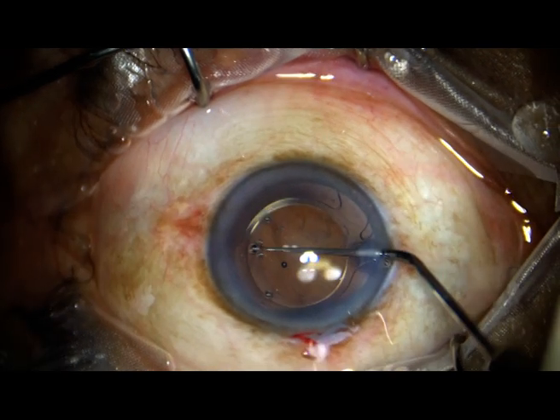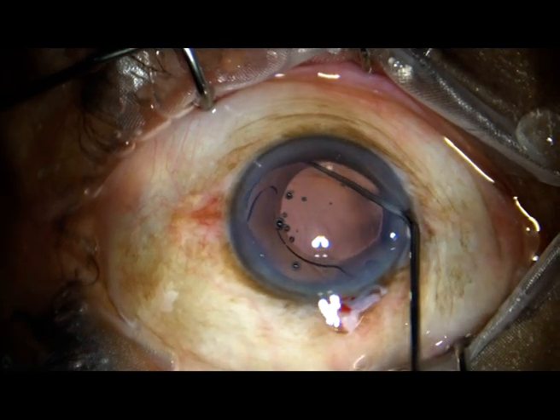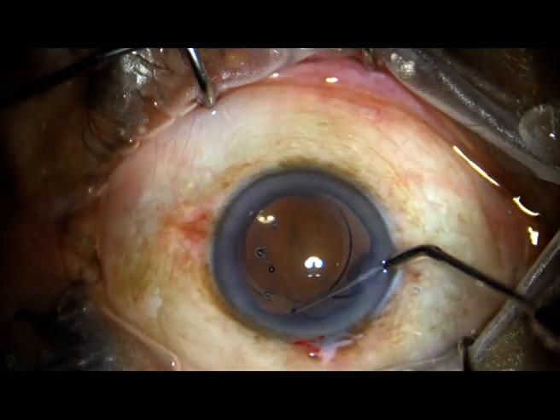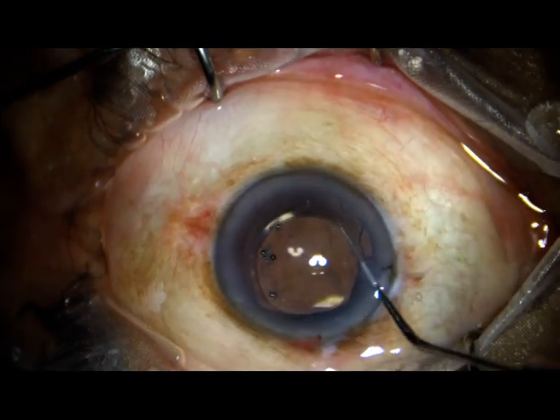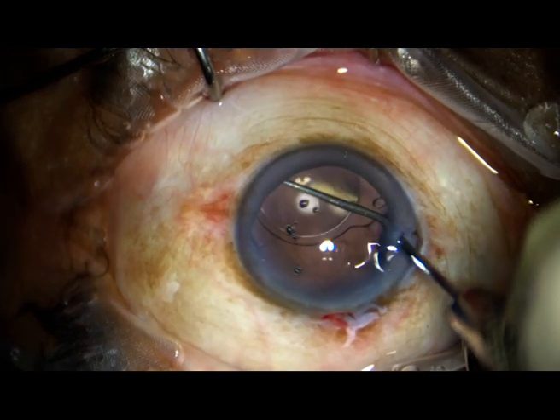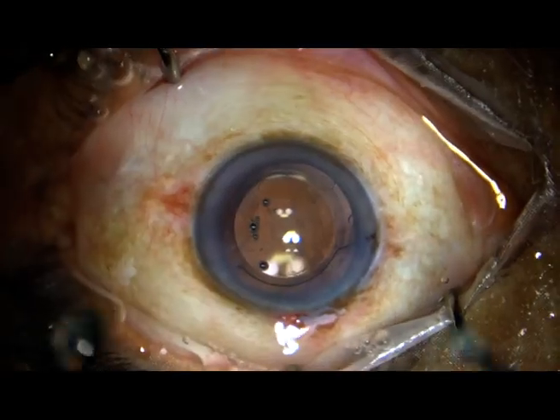Going through the right side port, I am placing this haptic in the sulcus. It has gone in the sulcus. Now I dial the lens and place the other haptic also in the sulcus. Both haptics are now in the sulcus.